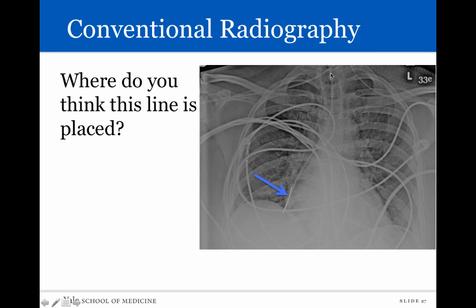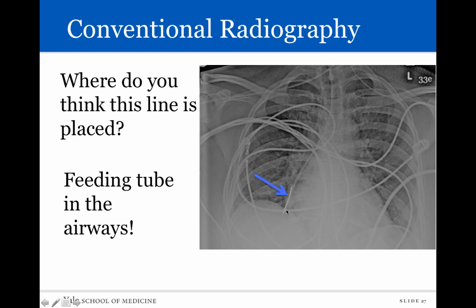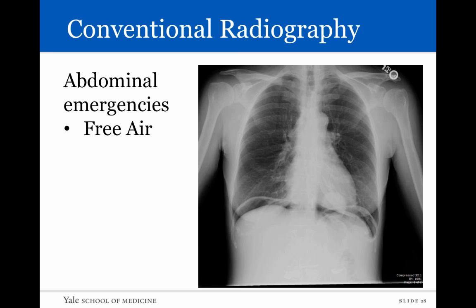If a line is in the wrong position — look at this line here, supposed to be in the stomach — where do you think it's placed? It was actually placed in the airways, so it's important to detect that so you don't initiate feeding and cause damage to the lungs. Conventional radiography is also great for some abdominal emergencies, for example free air. You should never have air inside your abdominal cavity — it should be located in the bowel. If that air escapes the bowel and goes inside the abdominal cavity, it causes free air as you can see here. This is an abdominal emergency and this patient would have to go to the operating room very quickly.